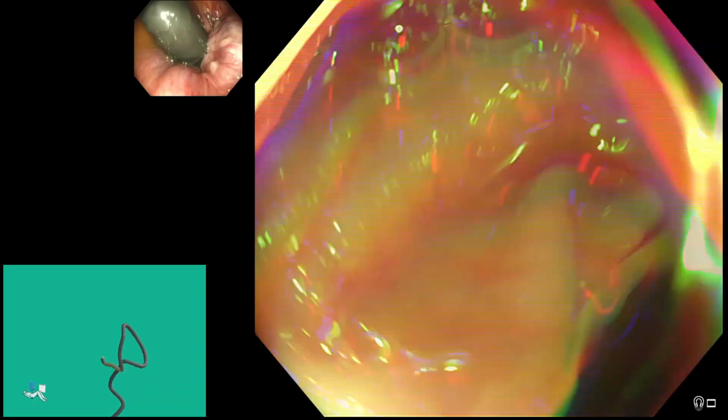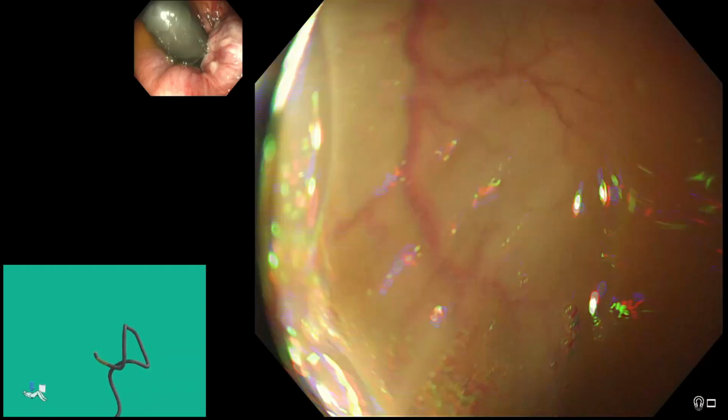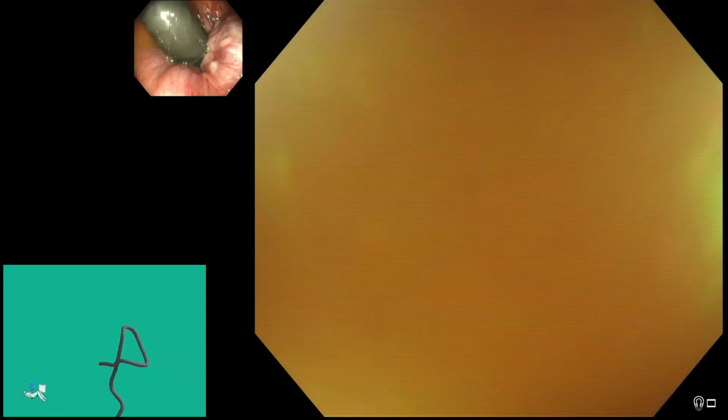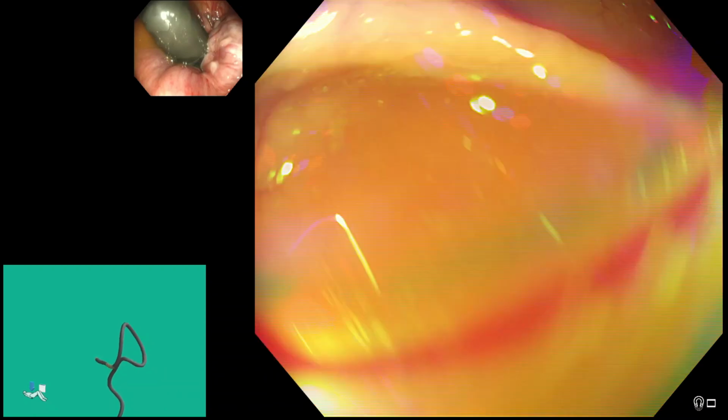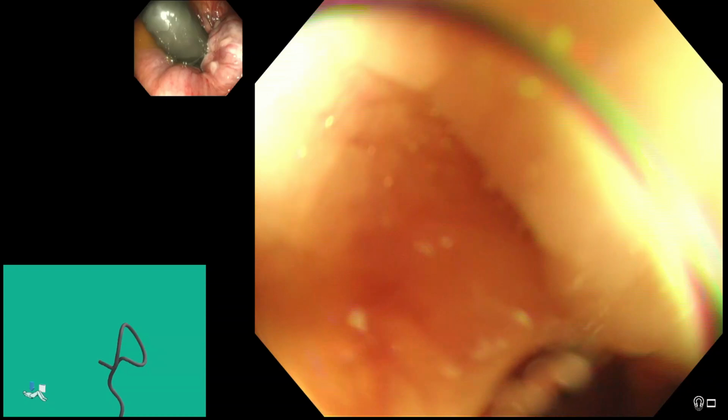So I'm in the transverse now. I'm not putting either water or air in at this point, and we're just sucking just to keep the colon sort of relaxed and corrugated over the scope, coming up to the hepatic flexure now. So I just put some carbon dioxide in. That's the first time we've needed to use gas.